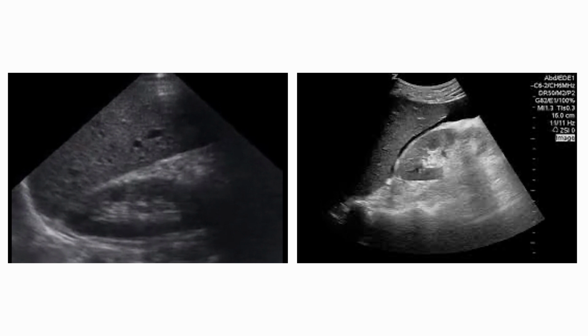So in this side-by-side view, we're able to see a normal right upper quadrant view on the left and an abnormal right upper quadrant on the right. On the left, we see an interface between the liver and the kidney, and we see more hyperechoic, so brighter white tissue there. That's indicative of some connective tissue, omentum, some other things, but not the fluid that we're looking for. Within the liver, we do see some dark black circles. Those are going to be vessels, which we'd expect to see within the liver.